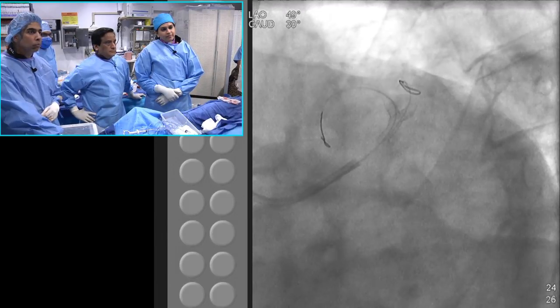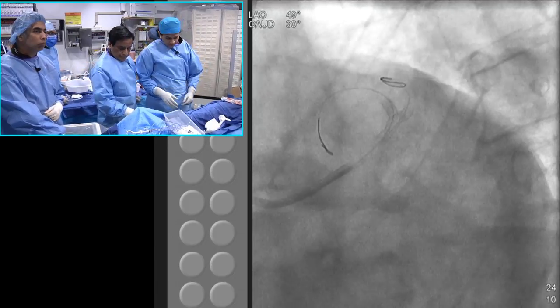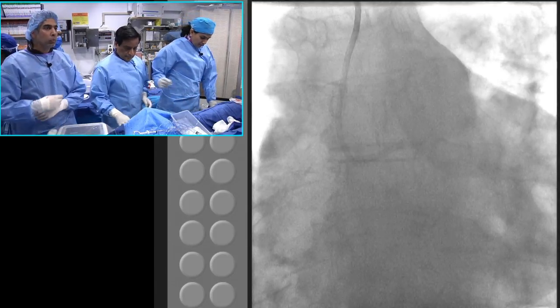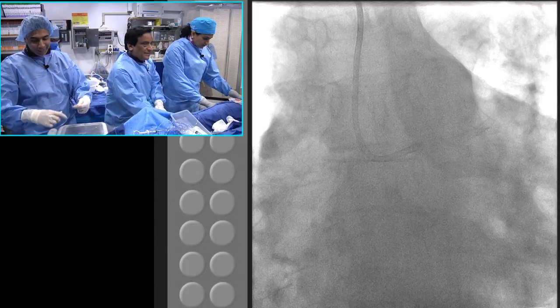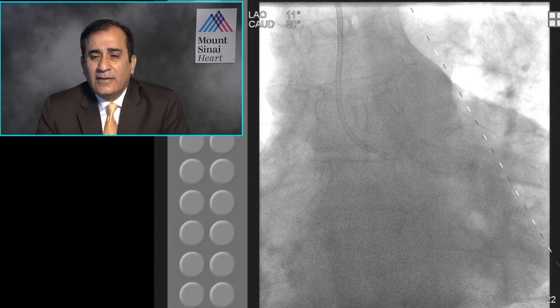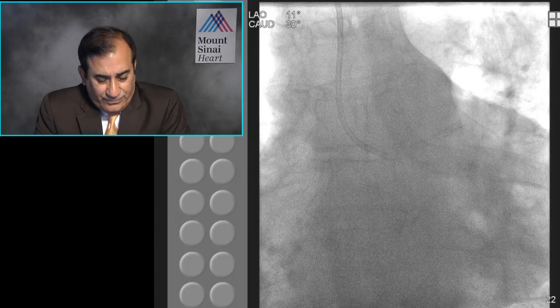Okay. You know, having watched so many of these cases where I have watched you do the vessel preparation, I bet you this would be a great instructional site whenever we have a BVS available. Yes. To prepare the vessel, I think, is the entire key, and I'm sure the majority of operators would not have gone with using any atherotomies or even the Flextome.